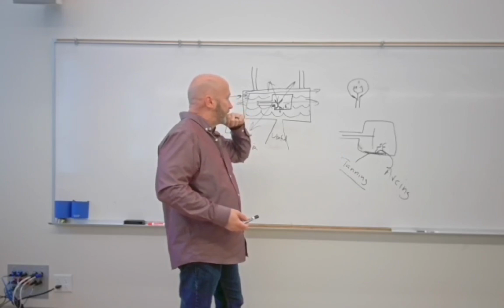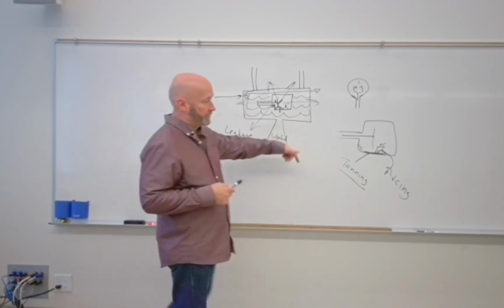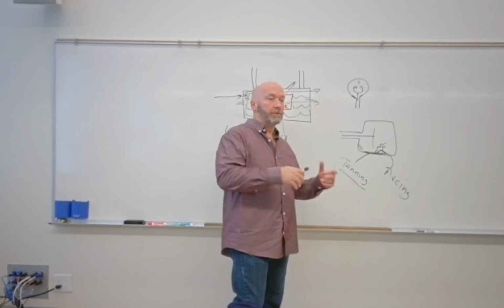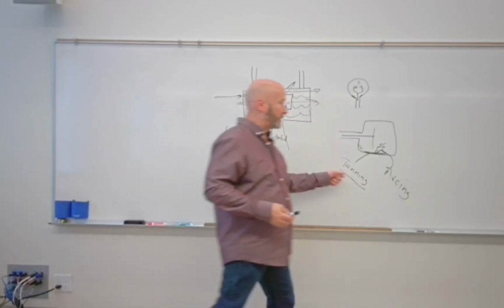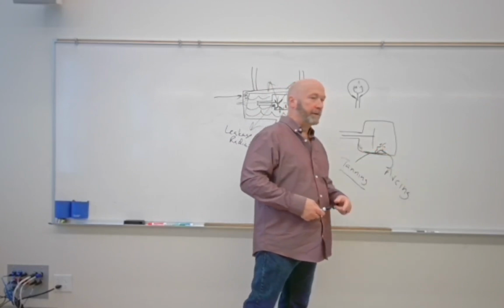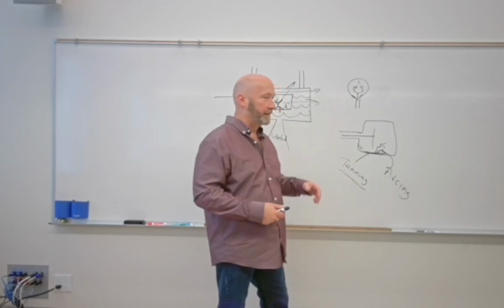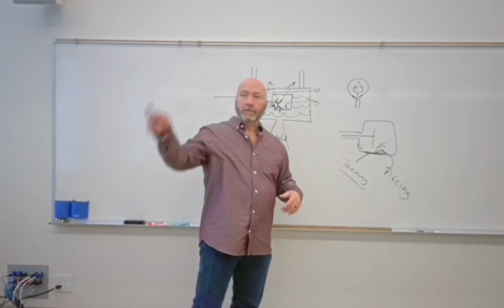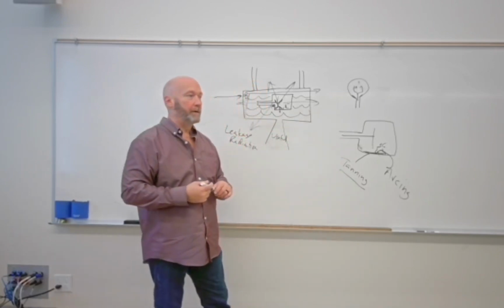So that's the most common cause of instant tube failure. Okay. So we've got a lot of different causes for tube failure, but that's one of them. Certainly, we could have an open filament, just burn one of them out, and we don't have an arcing issue there. Now, again, the tube that's coming around has a glass envelope, right?